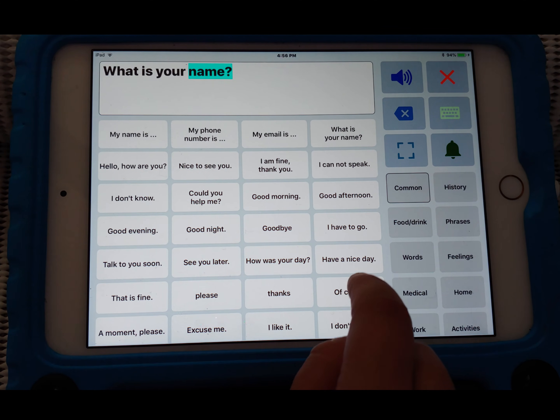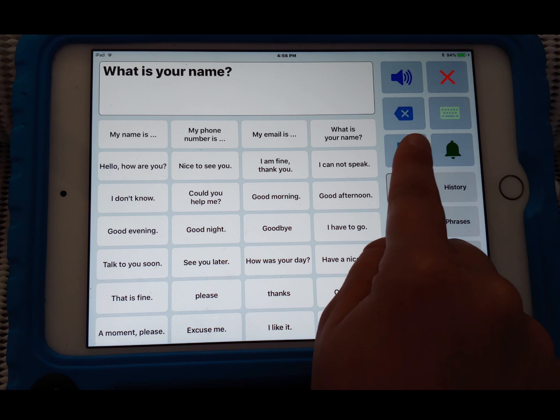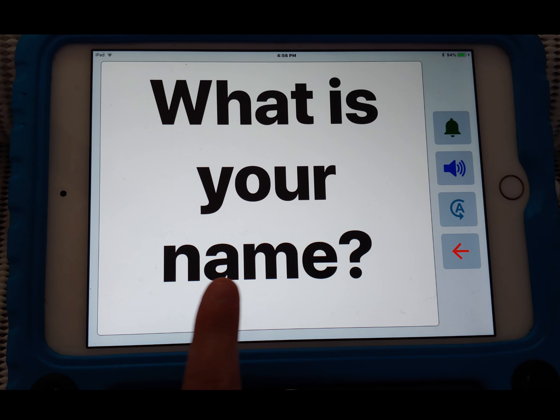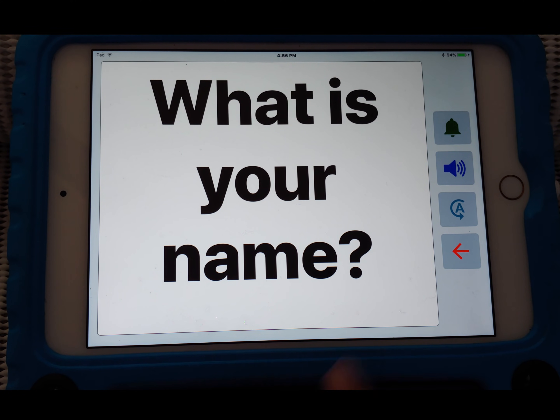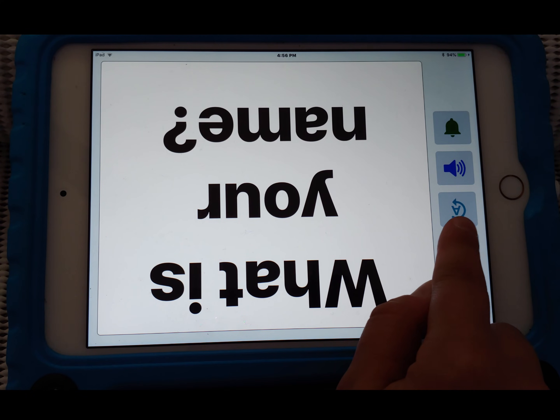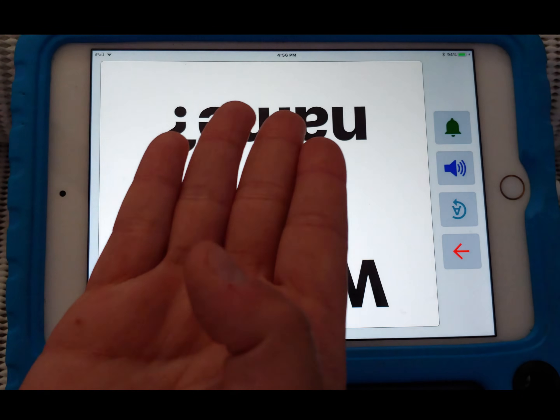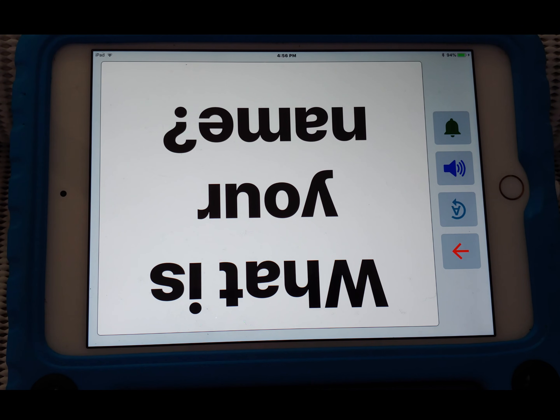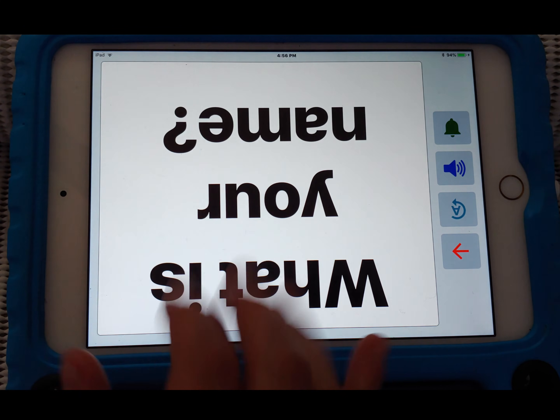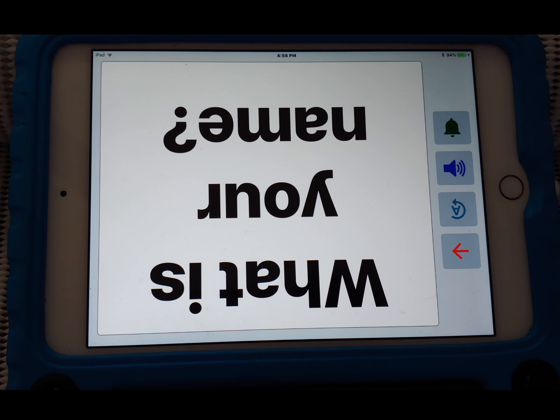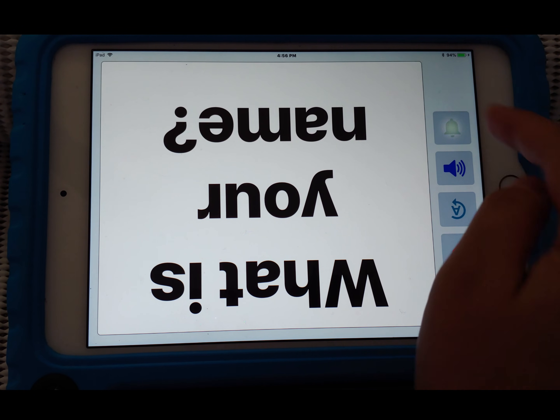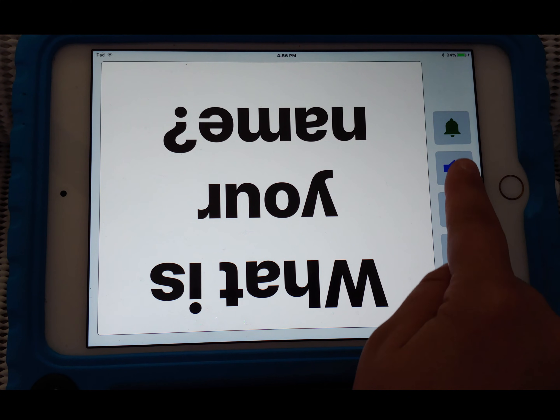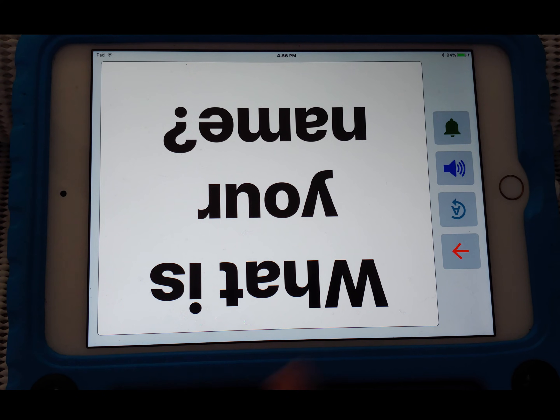If you press this box here, it actually enlarges the text. You can press the A and it'll flip over the text — so if somebody is in front of you or you want to hold up what you're saying, it's easier for other people to read. You also have an attention sound to grab someone's attention, and you can press speak to have it say the phrase out loud again. For example: 'What is your name?'